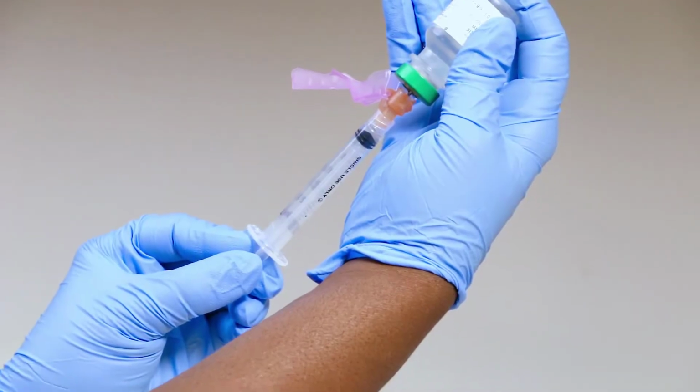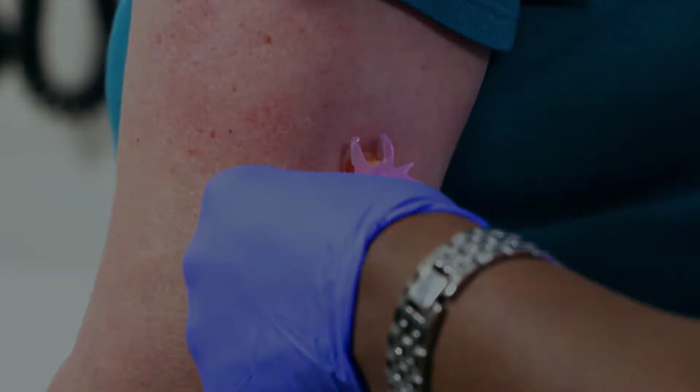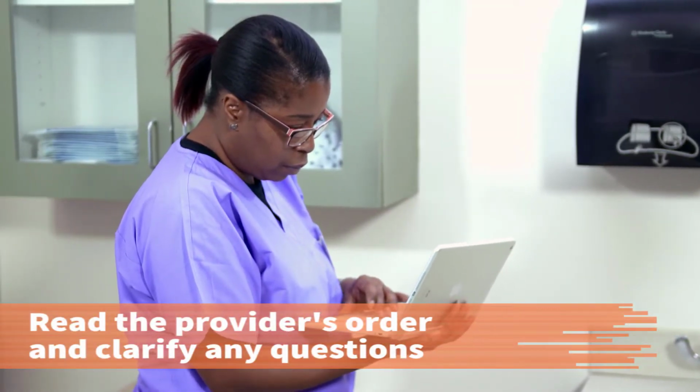In this procedure, you will learn how to inject medication into the subcutaneous tissue. Read the provider's order and clarify any questions with the provider.